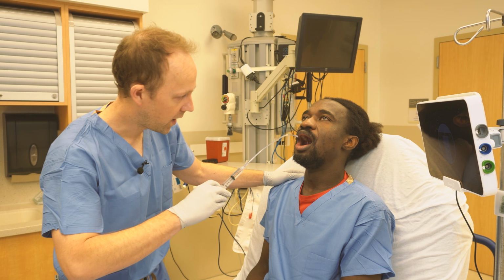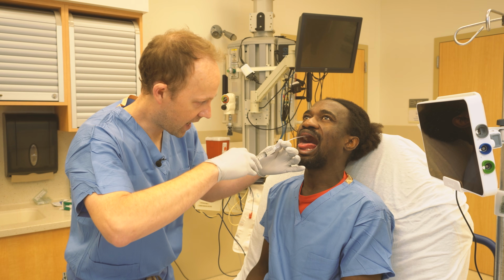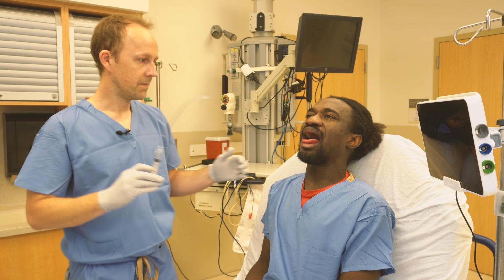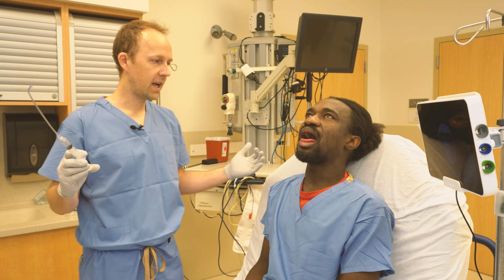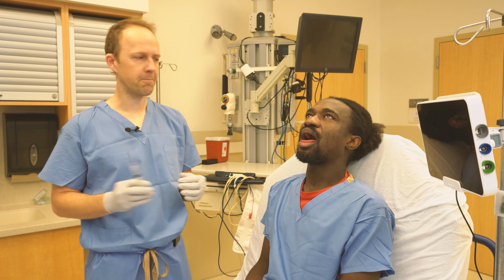Have the patient open up wide and stick out their tongue. They're going to cough and gag a little bit. Say, ah. Good. Sometimes this will induce gagging or rarely vomiting at the moment, but usually just spitting up.